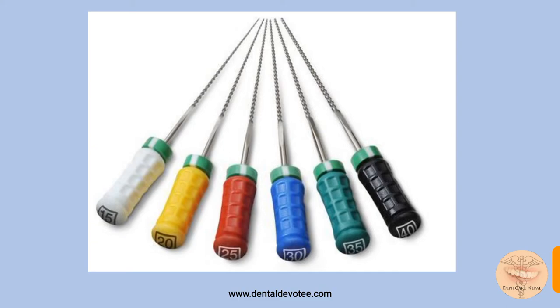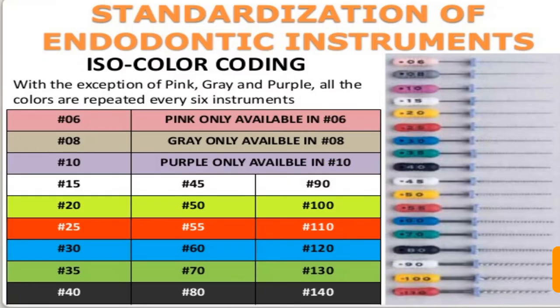Firstly, you need to remember that endodontic files are available in sizes 6 to 140, and from 10 to 60 they are in increments of size 5: 10, 15, 20, that is, in increments of 5. From 60 and up they are in increments of 10. So there's no 65 after 60; there's 70, 80, 90, and so on.